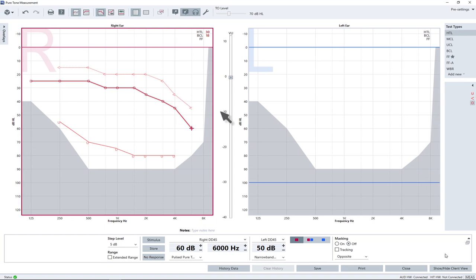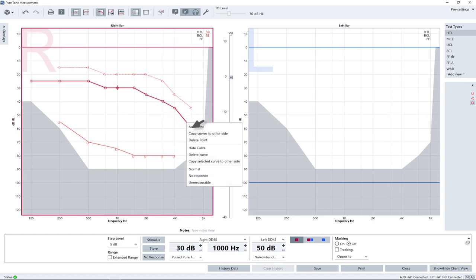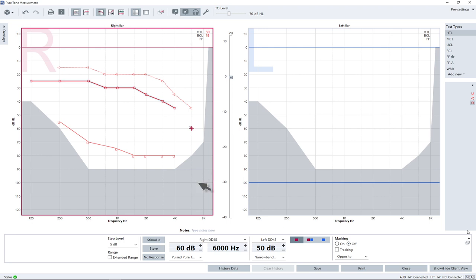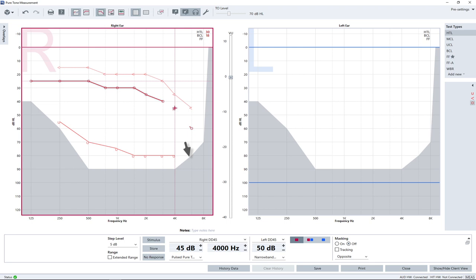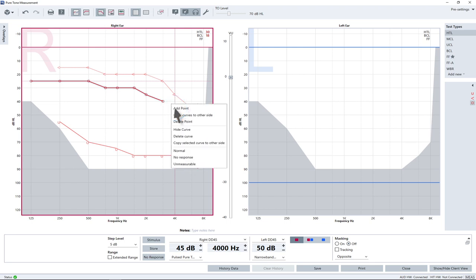To edit a threshold level, right-click the corresponding symbol and a pop-up window opens. Select the entries, unmeasurable or no response to change the symbols of the curve. With the entry normal, you can reset the symbols.